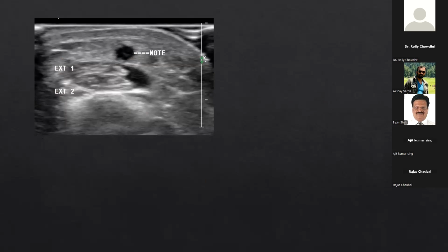So the first thing that we see, the first compartment tendons were absolutely normal. The advantage of ultrasound that we always learn is that we can put the probe where it hurts the most. The patient is in front of us, so we can see where the patient has maximum pain, and this was the point where the patient has maximum pain. So this is the first extensor compartment crossing over the second compartment, but there is no thickening.